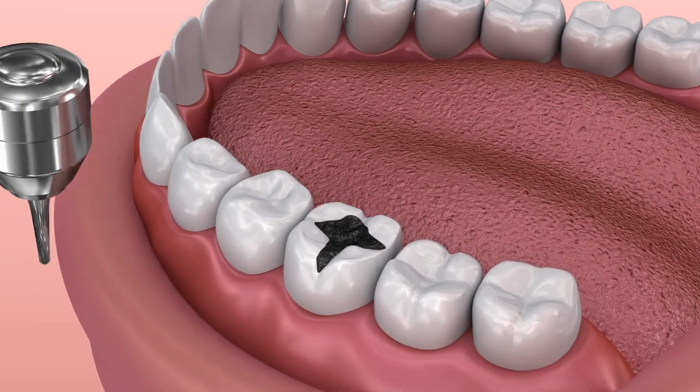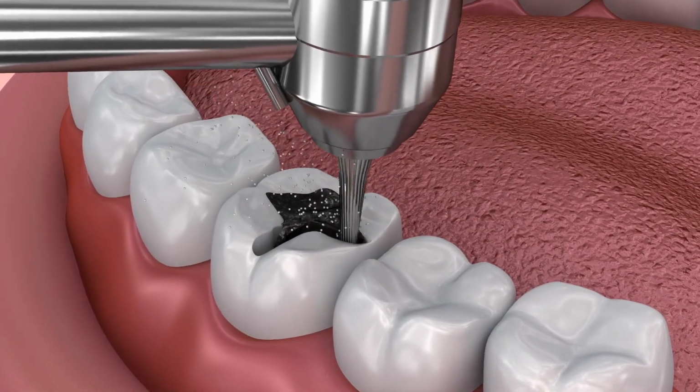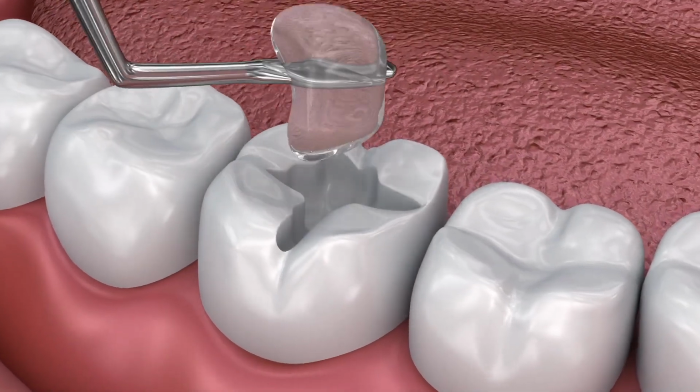Removing caries, step-by-step dental procedure. Dental caries, also known as cavities or tooth decay, is one of the most common oral health problems affecting people in the United States and Canada.